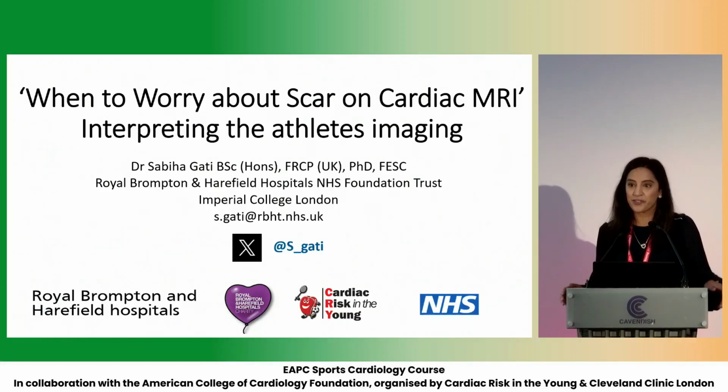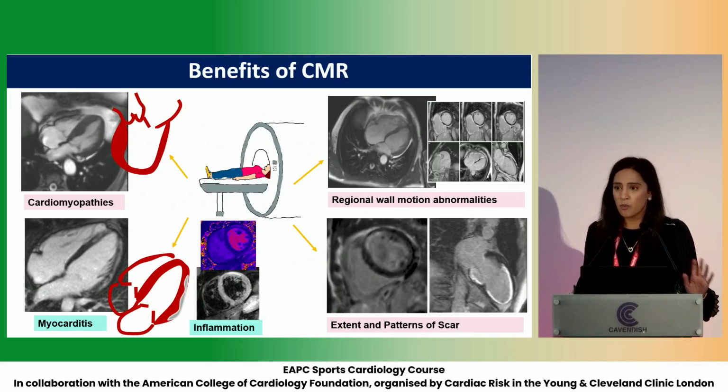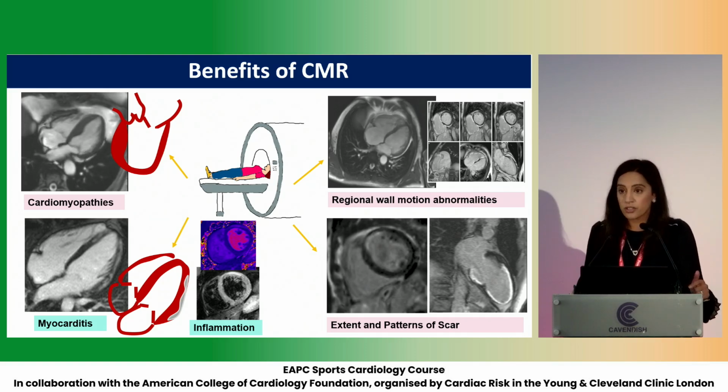Welcome to this conference and thank you for the invitation to speak on when to worry about scar on cardiac MRI. So cardiac MRI has become widely available over the last decade or so, and whilst it's unlikely to replace your relatively inexpensive portable echocardiography, it does have its benefits in certain patient cohorts. For example, for the evaluation of cardiomyopathies, to check for inflammation in myocarditis, to check for your subtle regional wall motion abnormalities and fatty infiltration, but also the extent and patterns of scar, which allow us to assess the etiology of the condition, risk of heart failure, and arrhythmic sudden cardiac death.